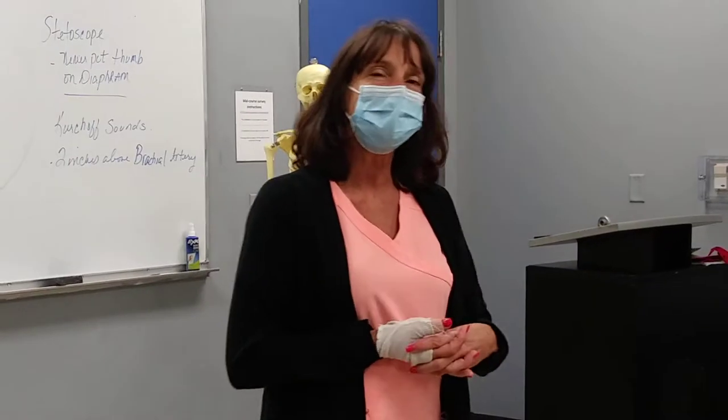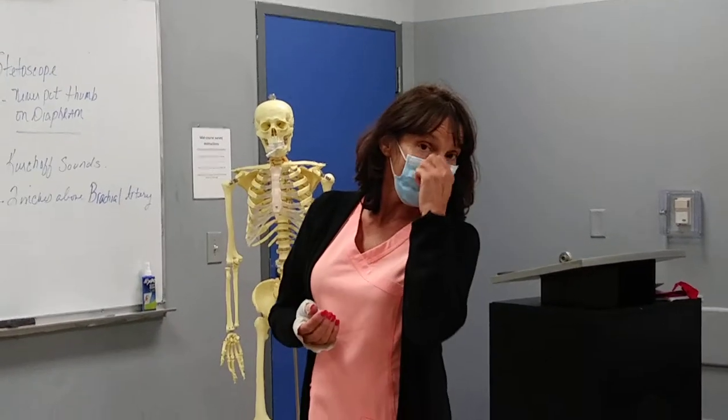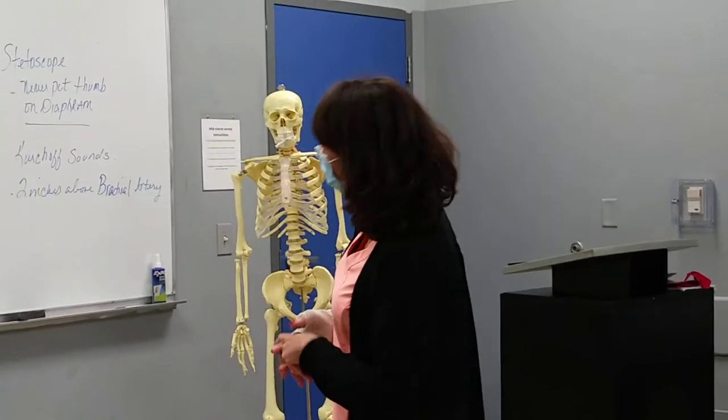A teacher here at Lincoln College, and we're going to learn the proper way to take a blood pressure. So let me give you some ideas first of the proper techniques to take a blood pressure.